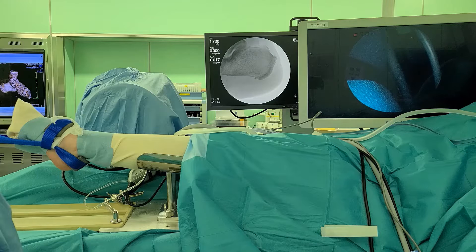The patient was placed supine on the operating table. The lower leg was sustained with a leg holder, and traction was applied to stabilize the operated foot. The fluoroscopy monitor and arthroscopy monitor were placed on the unoperated side, and the surgeon stood at the end of the operating table.